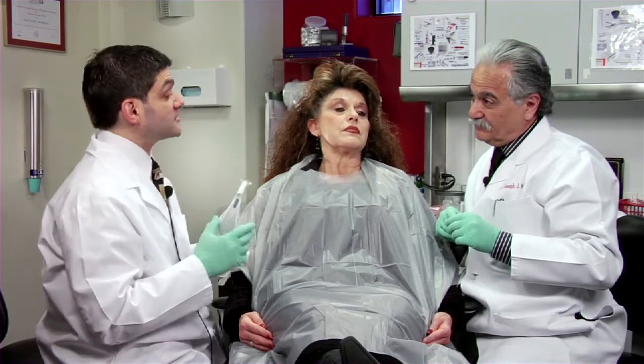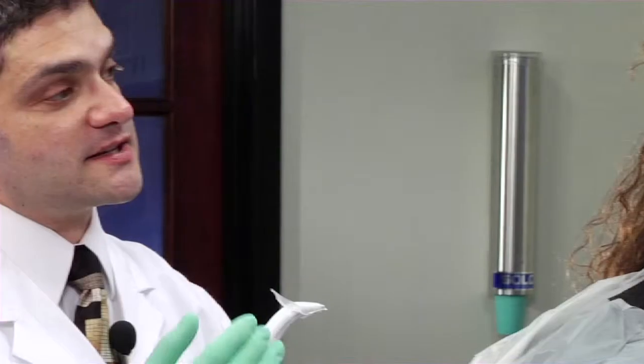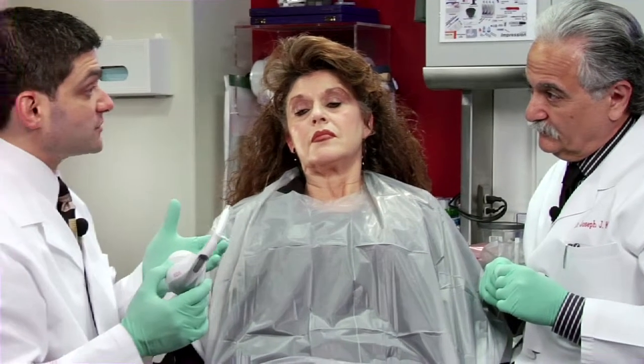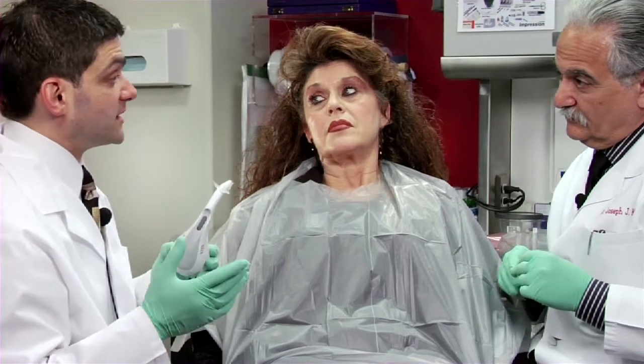In a combination case with removable prosthetics — for example, where I have a porcelain crown on a cuspid — we need to get the denture tooth as close as possible to that crown. What we do is visually select the shade we believe closest matches to the crown in the patient's mouth, input that shade into verify restoration mode, and it will actually show the differences in value, chroma, and hue to the technician — whether it's lighter, darker, more or less chromatic — so the technician can best match to that crown.